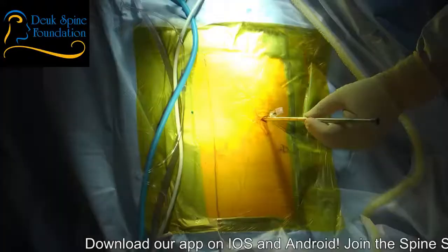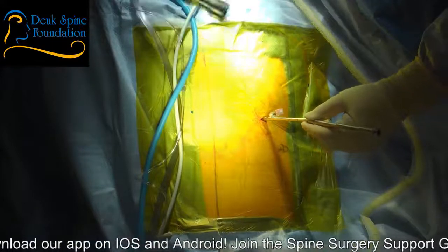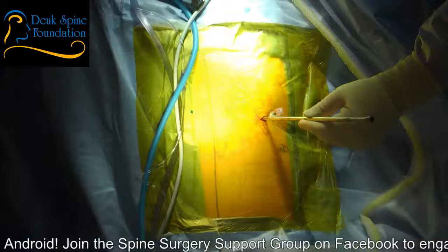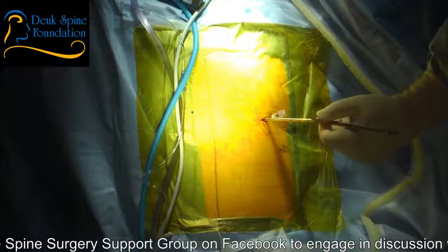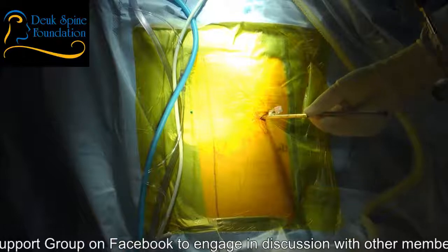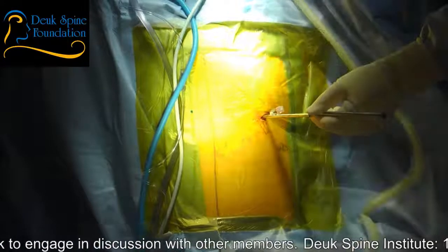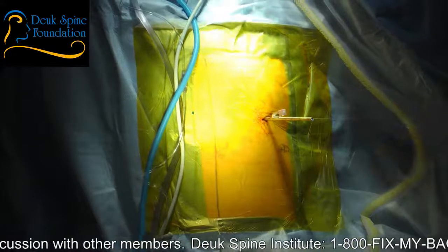And I'm going to do that using the X-ray to guide me. At this very moment that I'm pushing the disc herniation into the disc space, as I advance the dilator. Now it's important the patient's relaxed right now, which she is. She's perfect. Because if she's not relaxed, she's going to be tightening her back up, and that's going to make it even harder for me to get this dilator in. You see? But the more relaxed she is, the easier it is for me to get the dilator in.